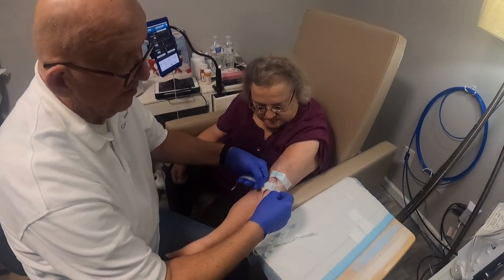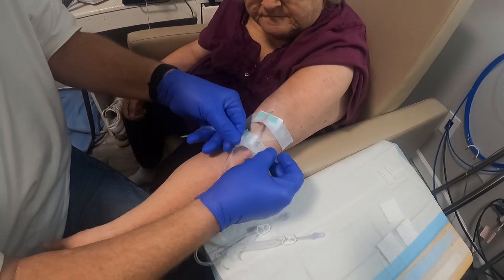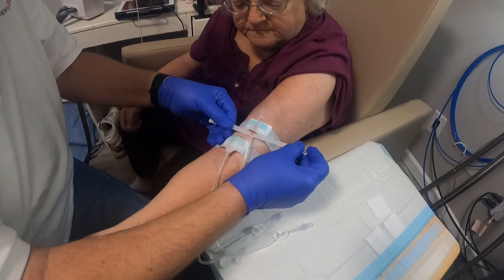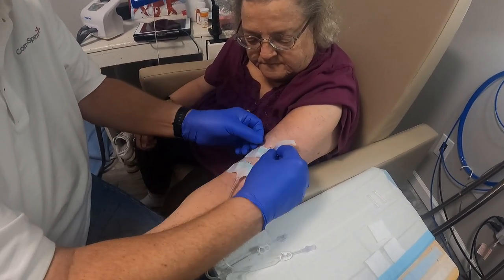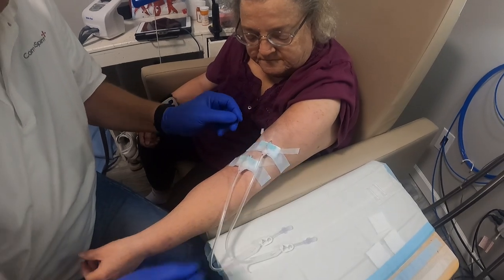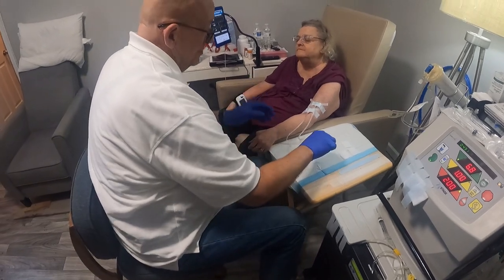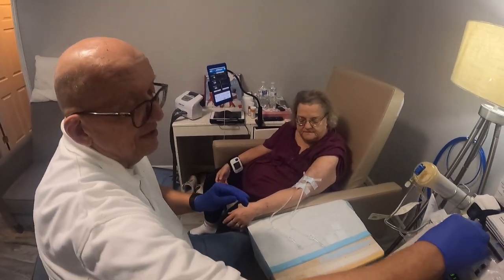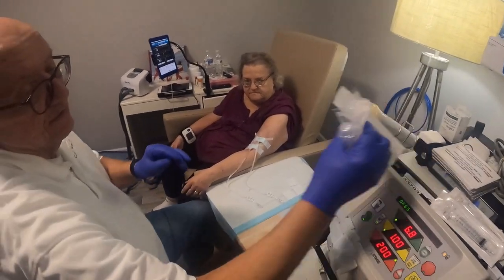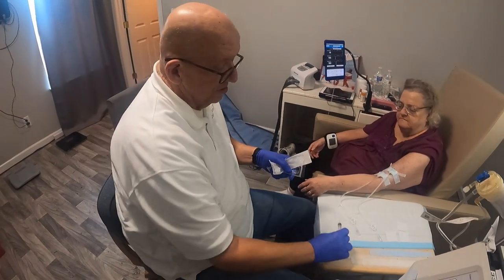And then another butterfly, right? Mm-hmm. Another butterfly. And this is a place where you can breathe. Mm-hmm. Once you got that far. I do this a little different than most people told us to. I like to just tear these off to get started.